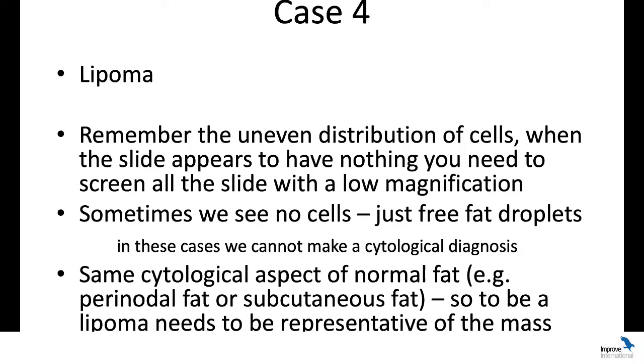And there's also the possibility that when you aspirate something that looks like a lipoma, or that looks like a fatty aspirate, when you go and stain it, it looks nothing like a lipoma, and it could be something like steatitis. So my advice is, if it looks like a fatty aspirate and then you stain it and it looks nothing like the well-differentiated adipocytes that we've seen, it's probably best to send it out. I hope I've clarified that question for that person.